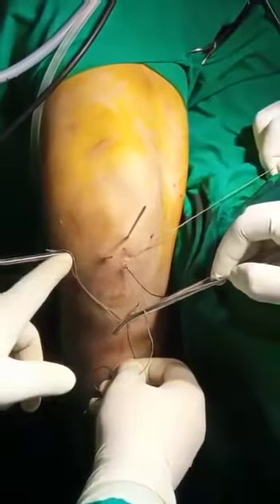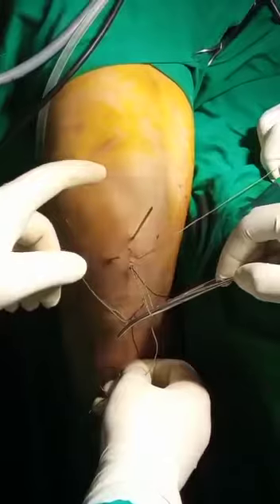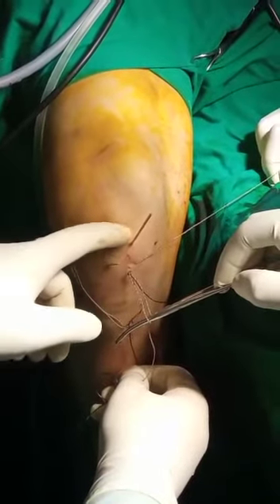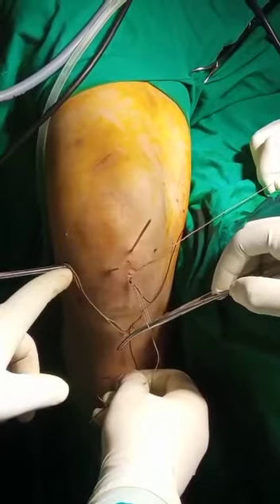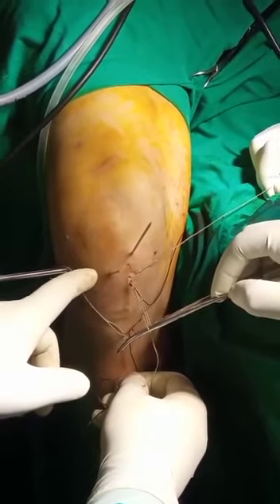This was done by arthroscopy. This is the anterolateral portal and this is the anteromedial portal. For the primary reduction, we held it with K-wires and then passed one fiber wire from the lateral tunnel.